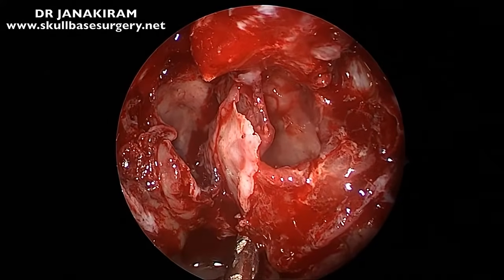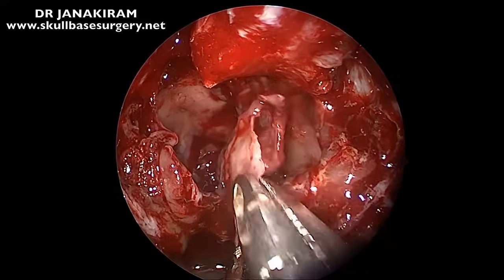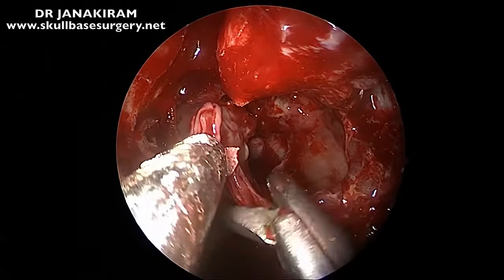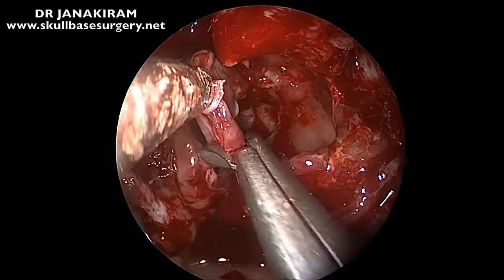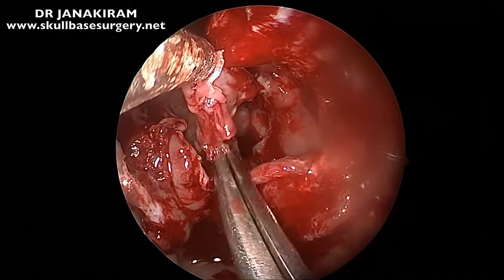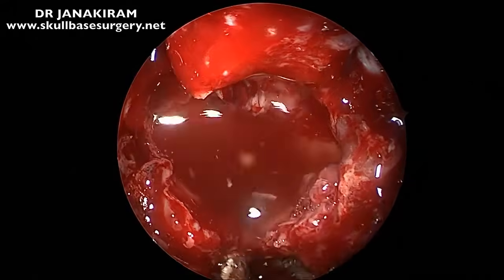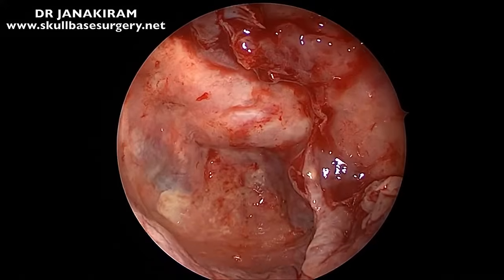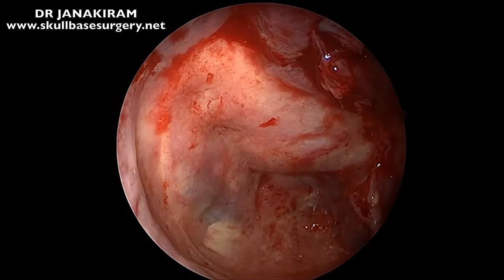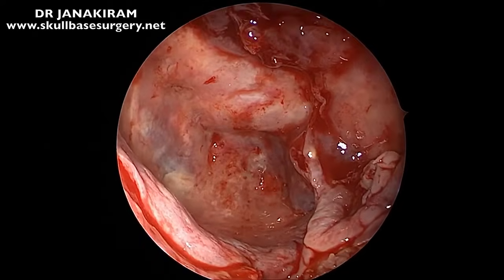And once we have separated that, we'll be using a Blexley-Weil forceps to remove only the bone there. And then the excess mucosa is removed using a through-biting forceps. And once we give a wash, we can now see the structures very clearly. And now we are going to study the structures related to the interior of the sphenoid sinus.